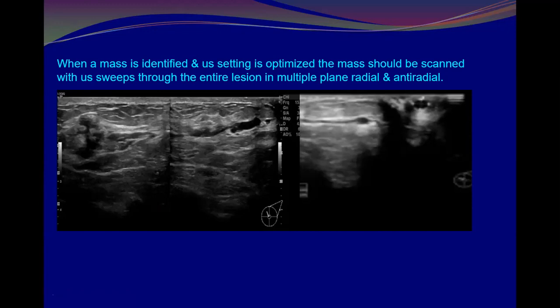Split view, double images, parallel to each other. Excellent. Well done. This is split. We call it what? It has a name. The technique we said last time, we have panoramic. This is not the panoramic. If it is panoramic, I can use it for measurement.